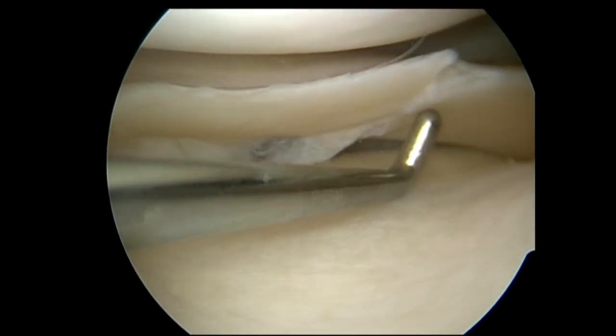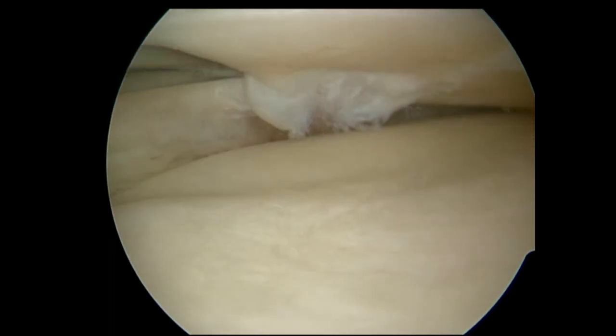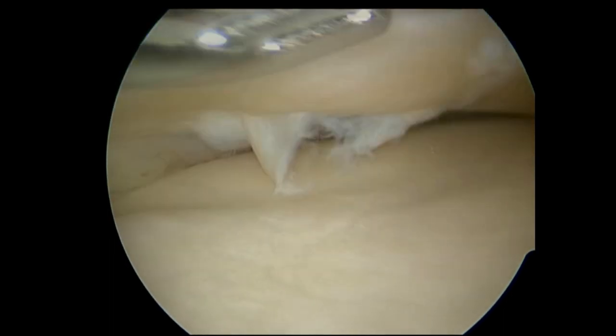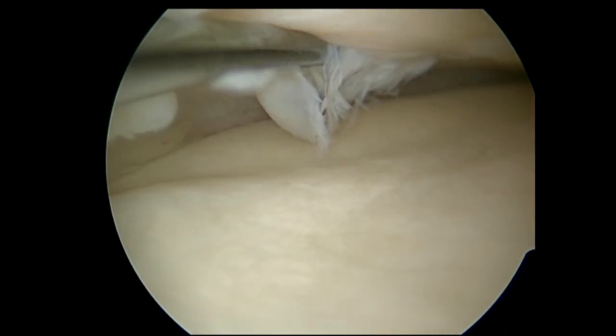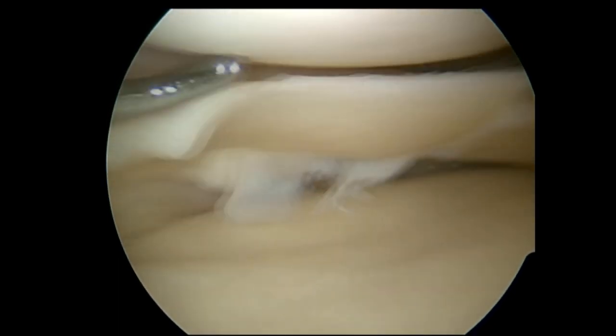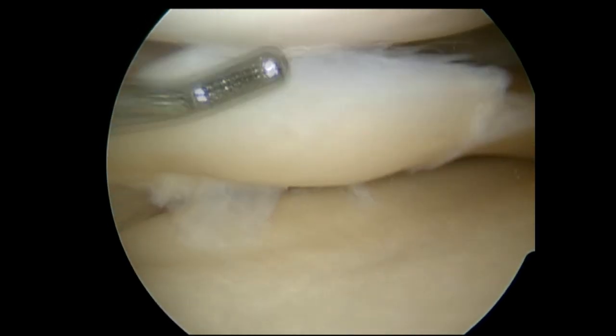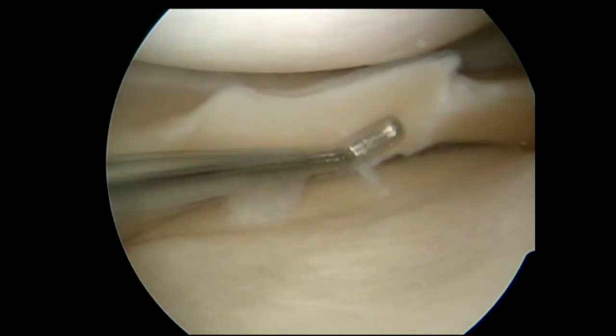So that's a meniscal tear. This is me looking into somebody's knee — a left knee. That's the medial meniscus, posterior horn. And when you look on the MRI scan, you may see a line. It may be slightly unimpressive, but if you do an arthroscopy, you actually look inside and you can probe. So you can see it for real, probe it, and feel whether it's unstable and how bad it might be.